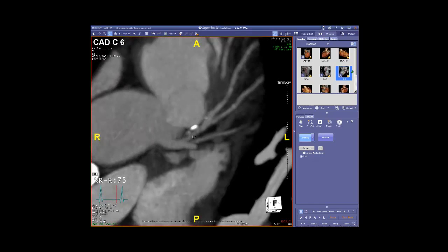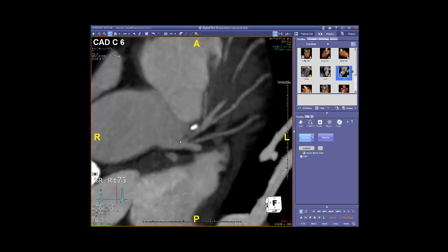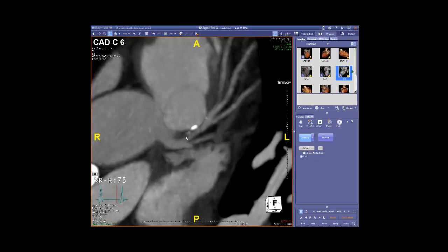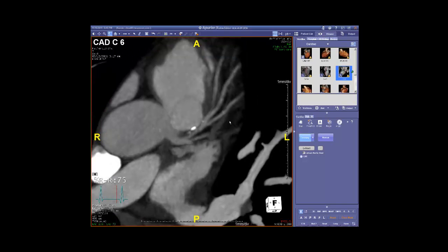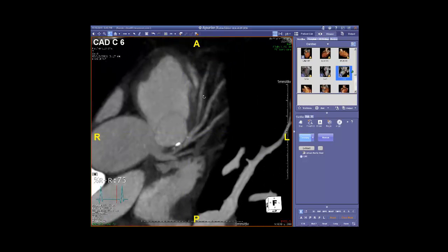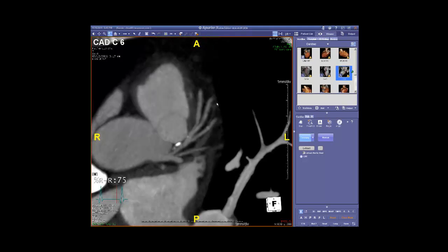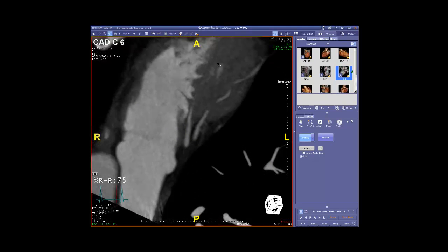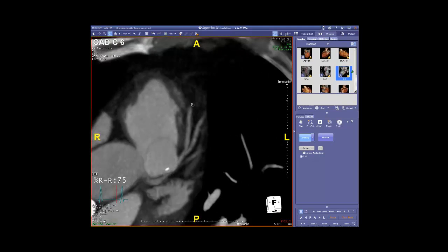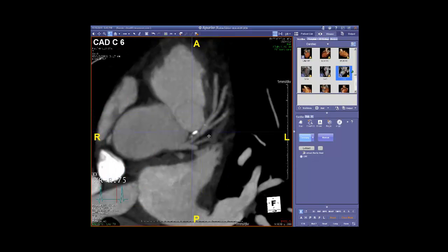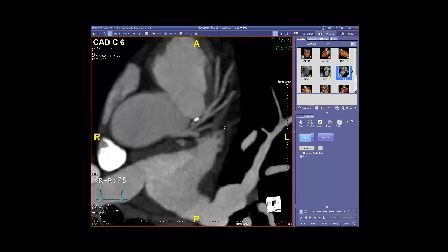So there's some mixed-density plaque here in the left anterior descending artery. The vessel is somewhat what we call positive remodeling — it's swollen a little bit. If we look at the diameter stenosis, comparing this section to this section, we can see that the lumen itself is not severely compromised. There appears to be a moderate narrowing of the lumen, even though we do have some plaque here in the proximal LAD. Looking at the more distal vessel, we can see some branching diagonal branches. Rolling out the vessel, we really don't see any significant disease further on, so this does not appear to be a lesion that's likely causing the patient's symptoms.